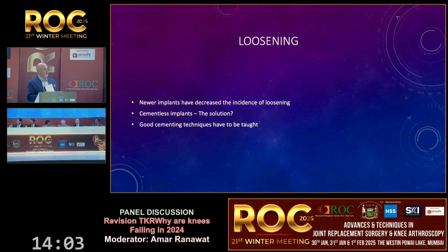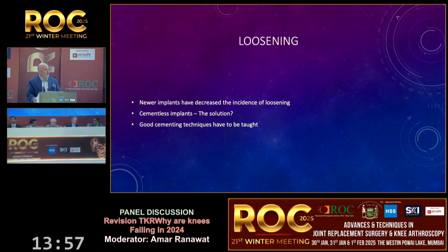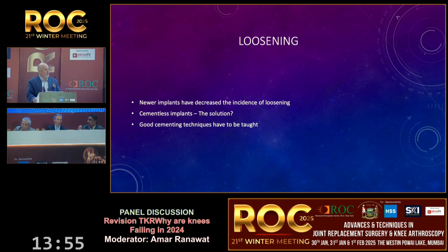We don't have experience with cementless knees, but the literature says that, at the end of the day, it is the osteolysis of the cement particles which is giving the delayed aseptic loosening, which will be negated by cementless. That's my feeling. And in THR, the experience of cementless hips, yes, we have. So we feel that it can be the future, at least for the femur.